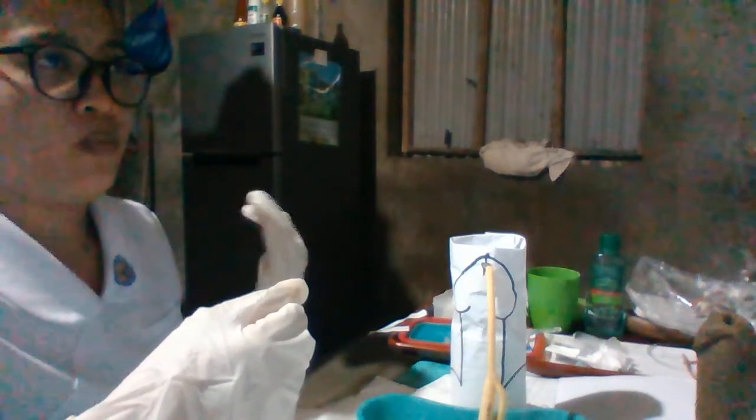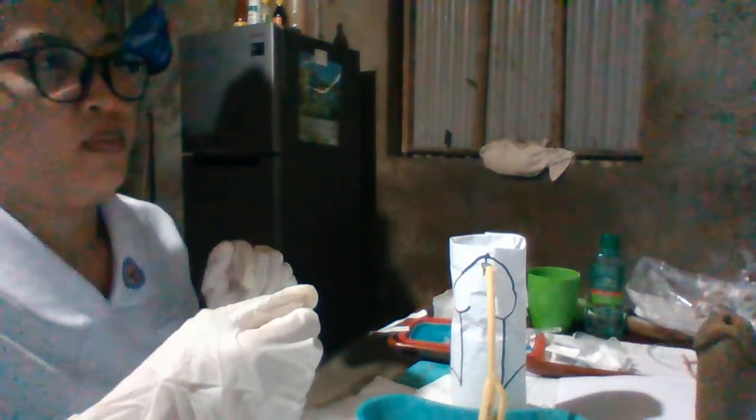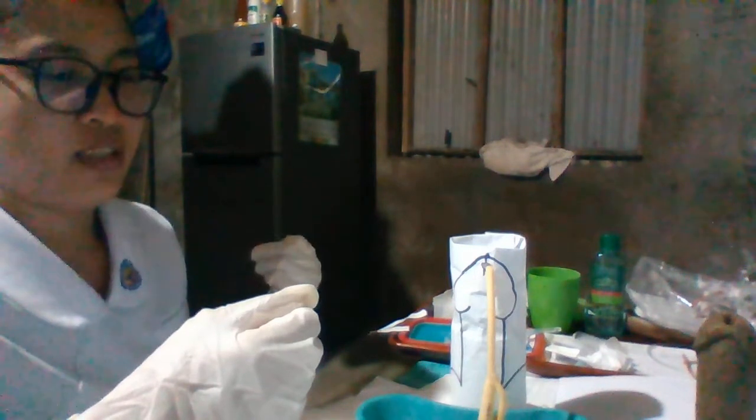And afterwards, for a straight single use, pinch the catheter and remove it slowly and smoothly when urine ceases to flow.